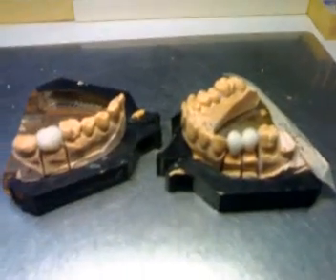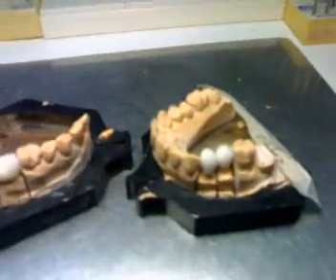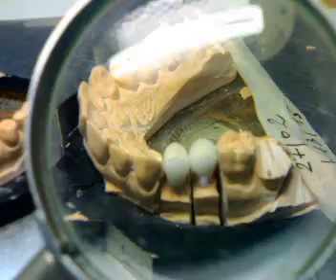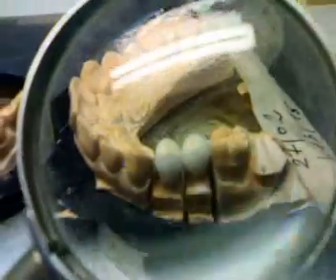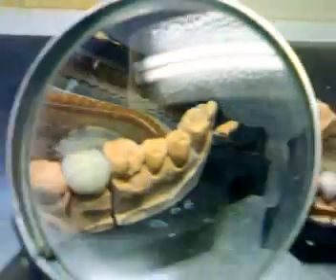At this point, I have grinded in, finished, and worked on the surface of my crowns, and they are ready to be cleaned before being glazed. I will be cleaning them with steam.